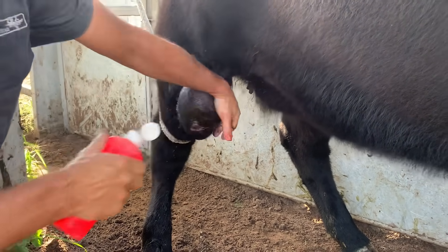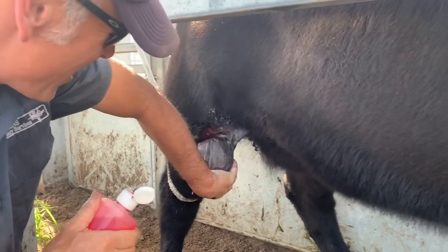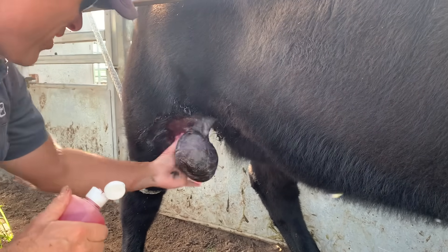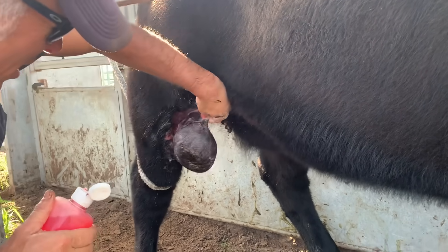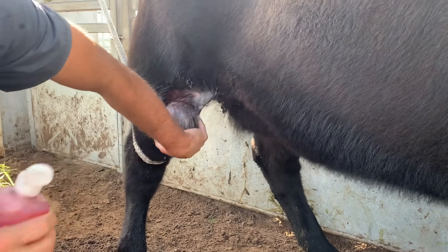A little scrub for her — this chlorhexidine scrub, good stuff. We just finished AI on this girl. That's a really weird little mess — that'd all just be fat. There'd be a big old bleeder supplying that, coming in probably here from the top.